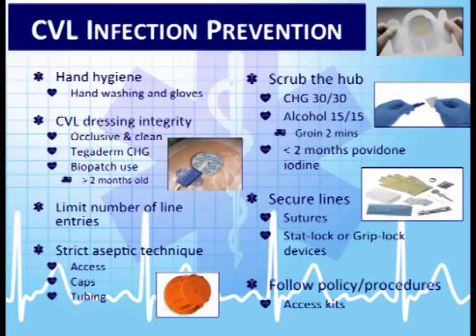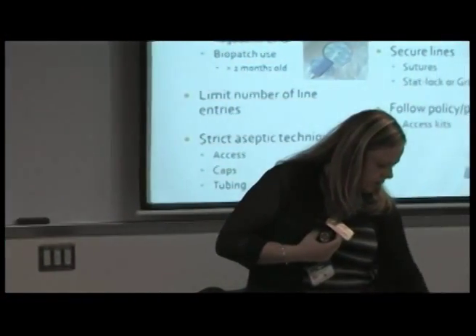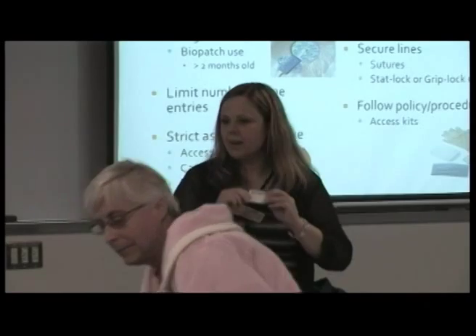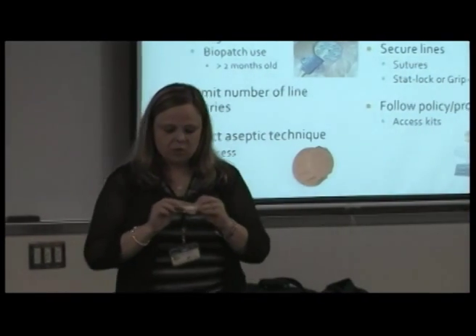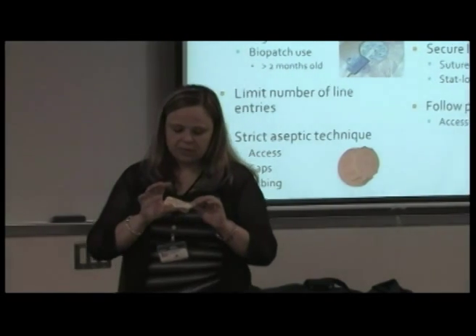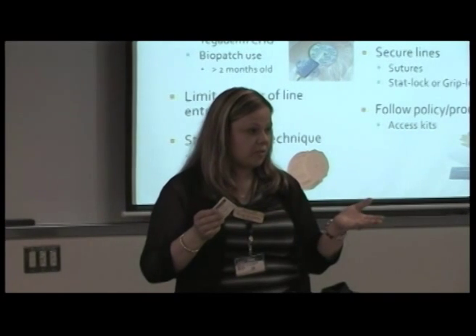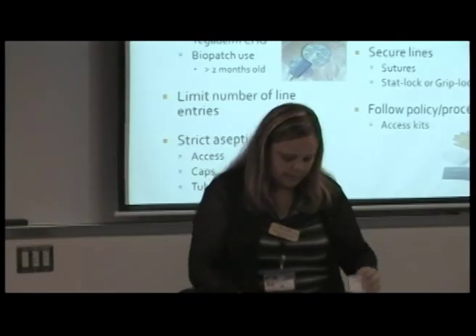Scrub the hub. So if we're using chlorhexidine, some of our services may have these little chlorhexidine wipes that we're used to seeing on IVs. I know some other services said, we're not buying these. We have alcohol, and that's what we're going to use. So either way, if you have alcohol, it's the 15 seconds. If it is the chlorhexidine, it's 30 seconds, depending on what device. Unless your medical director has something else in your protocol, but those are usually the adopted guidelines.